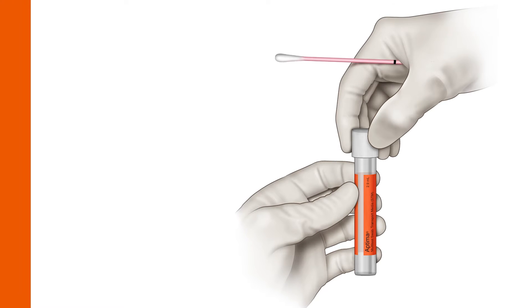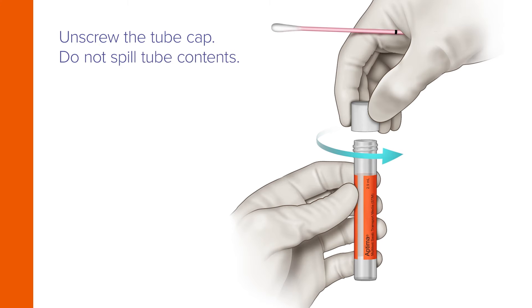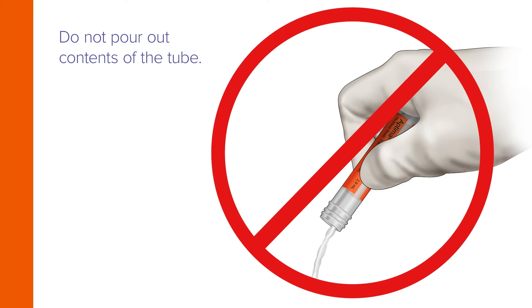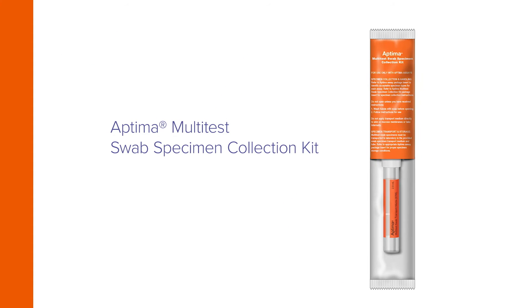While holding the swab in hand, unscrew the tube. Do not spill the tube's contents and do not pour out the contents of the tube. If tube contents are spilled, discard and replace with a new Aptima Multitest Swab specimen collection kit.